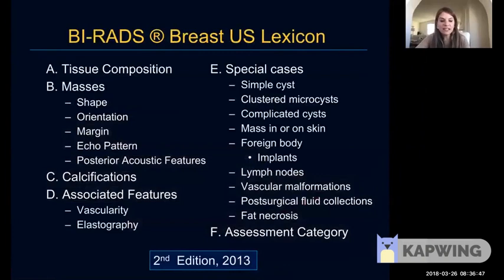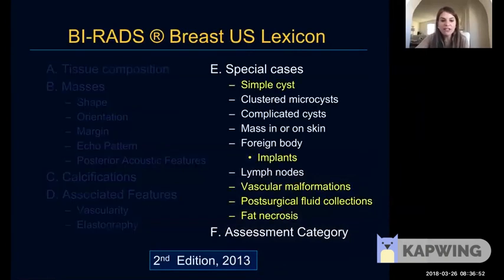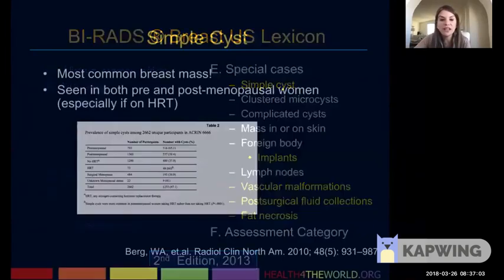Moving on, in our second edition, we have all these categories. We've covered that first half, and now we're going to move on to the second half, where we talk about special cases, and I've highlighted in yellow some of the new changes in the second edition for the breast ultrasound lexicon.